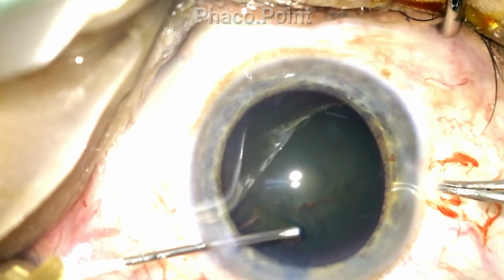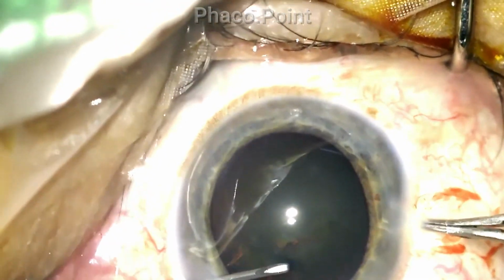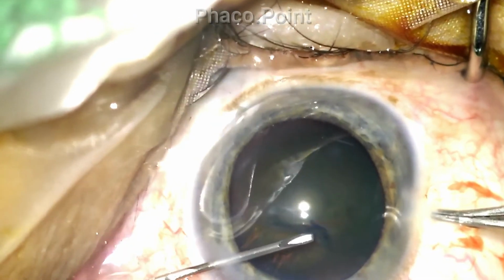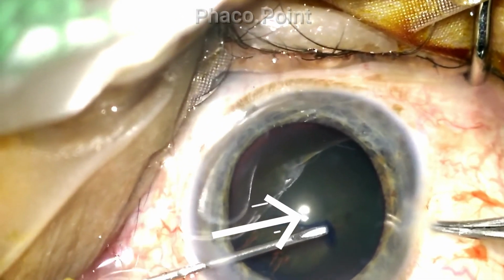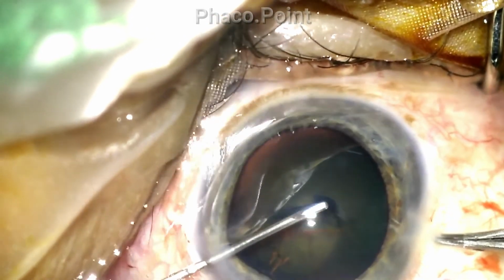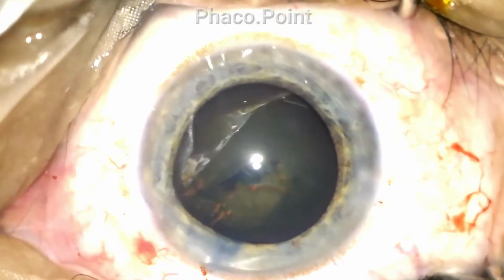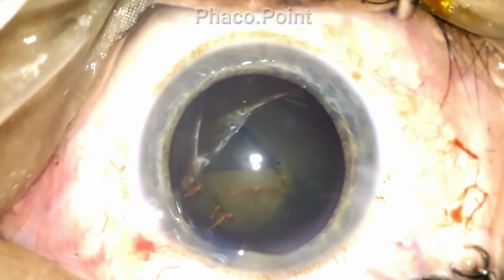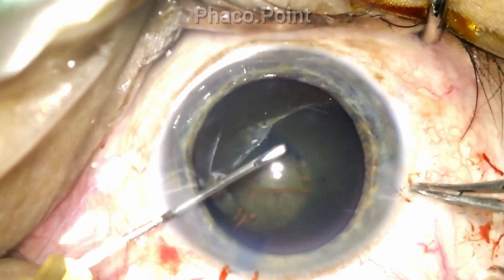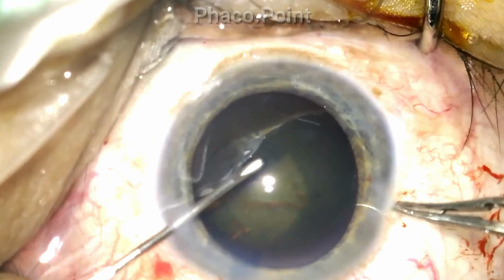You will notice how I am unable to actually enlarge the rhexis to the size that I desire. Perhaps at the outset, should I have chosen to enlarge the tear towards the center and then raise the flap, perhaps then I would not face this resistance. I now proceed to complete the rhexis.